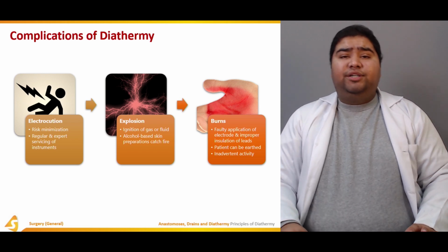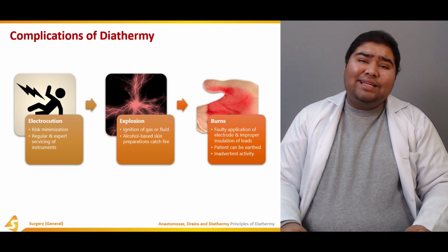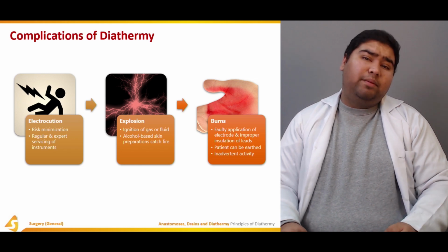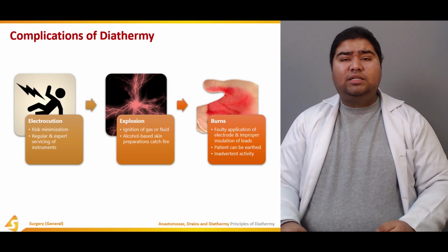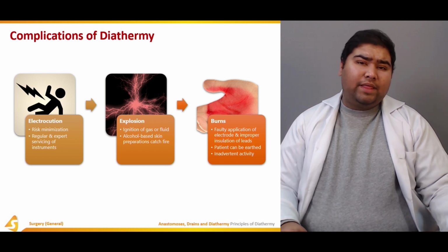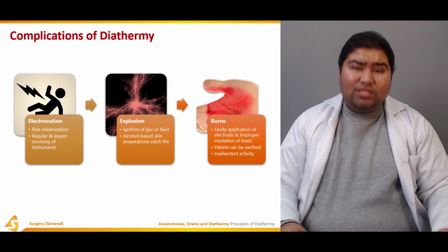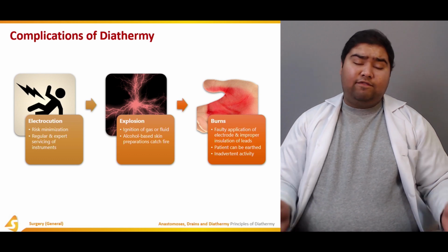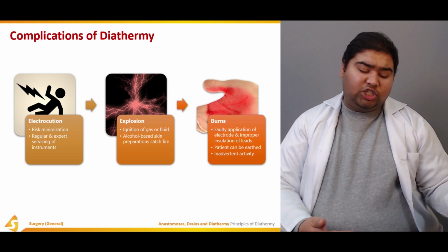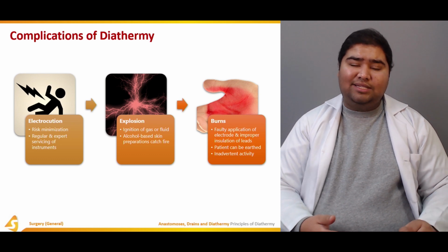Now, it can cause burns. We've talked about it in principles of diathermy, that diathermy is responsible for the production of heat. The diathermy works by the production of heat. Now, excessive production of heat can result in burns. So, if there are faulty devices, if your instruments are not insulated properly, if your instruments are touching each other during your procedure, or the insulation on your instruments is weak, you can damage yourself and your patient as well.